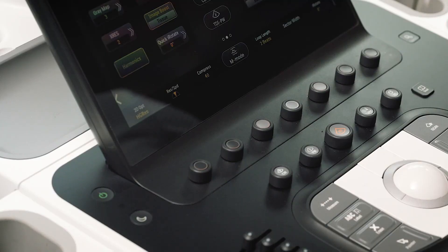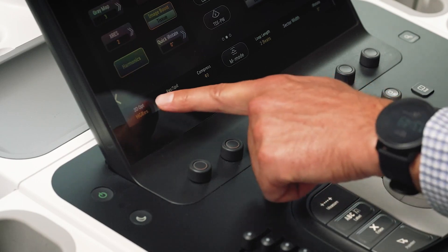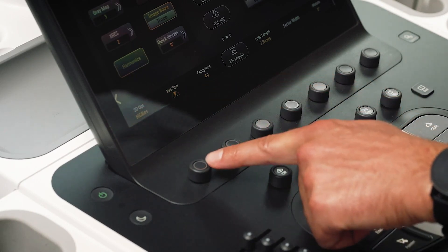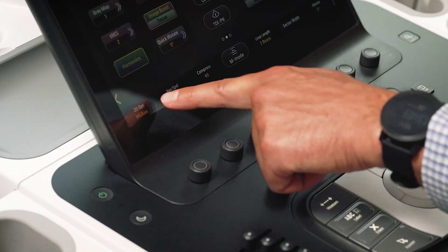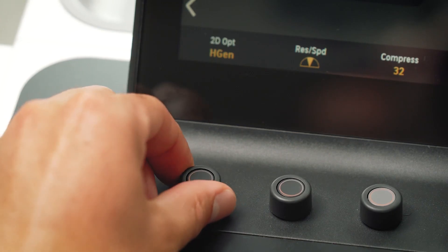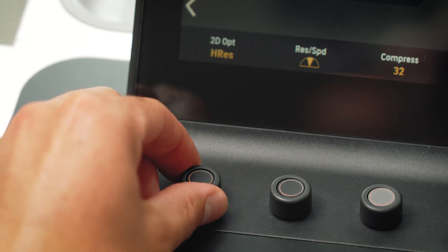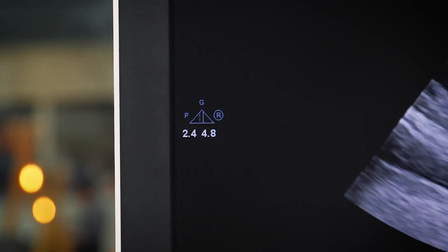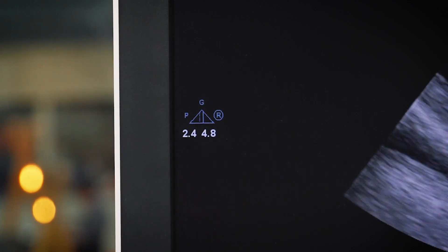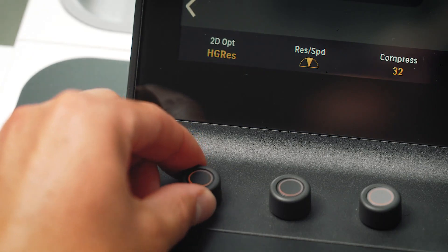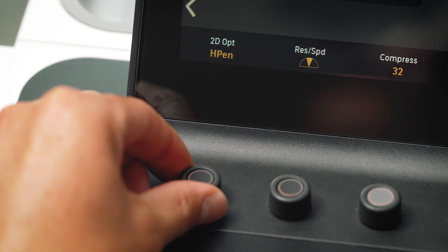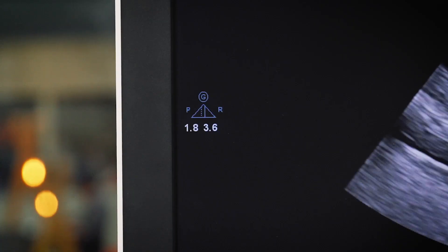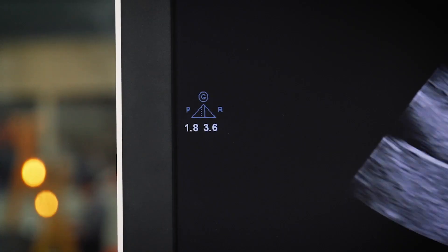2D optimization settings are found on the left of the touchscreen. This optimizes the 2D scanning frequencies to allow for patient differences. There are 5 settings. Moving towards H-Res will optimize higher frequencies and moving towards H-Pen will optimize lower frequencies.